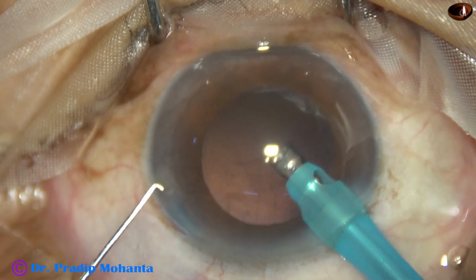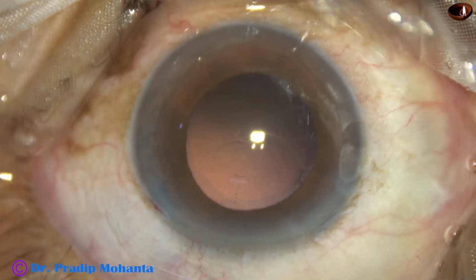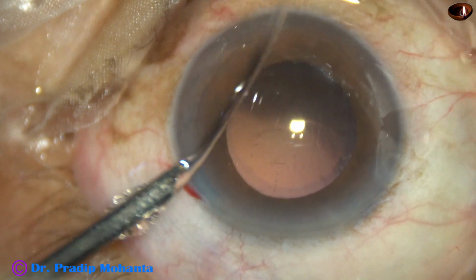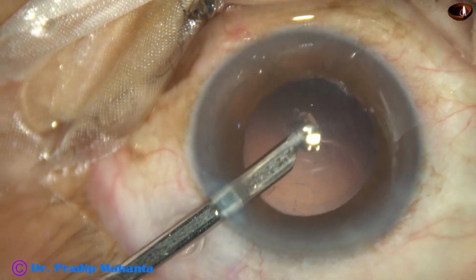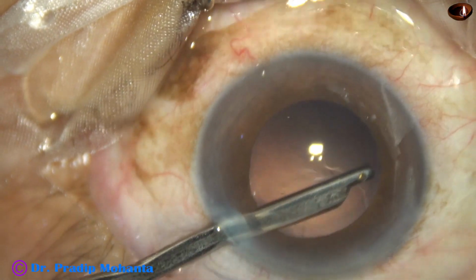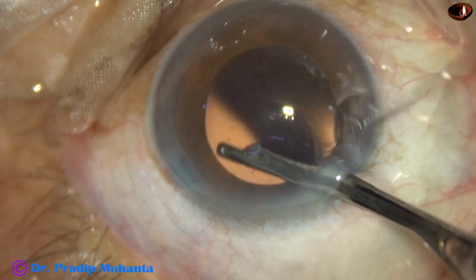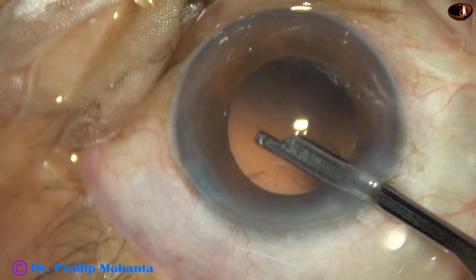And at this time, I don't think anything happened. Posterior capsule appears okay. Go with the Simcoe and remove the cortex. Go with the Simcoe and remove the cortex from this side.